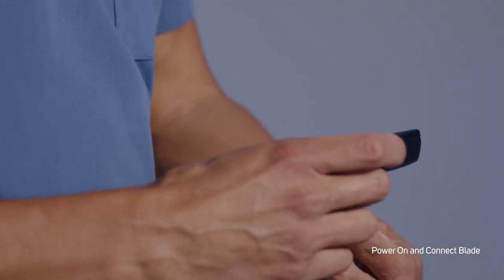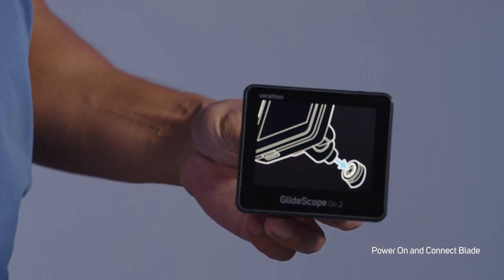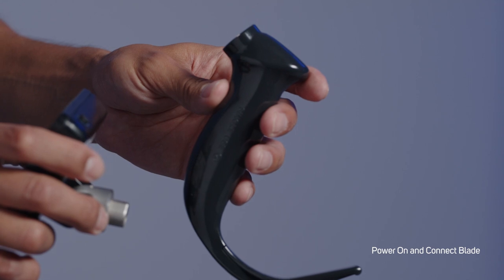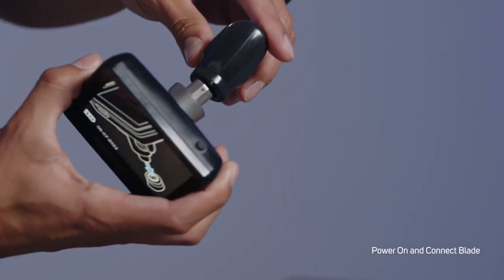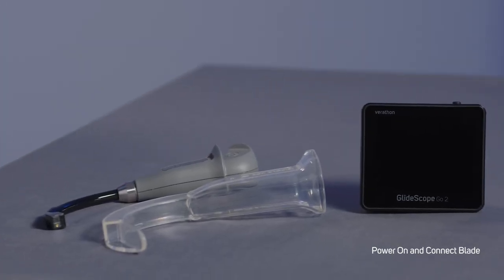Press the power button to turn on the device. The connection splash screen will appear showing that you need to connect a video laryngoscope. Choose your blade. I'm using a Spectrum QC Hyper-angulated S3 blade here. To connect, align the gray dots of the GlideScope Go 2 and the Spectrum QC blade. When aligned correctly, the two will magnetically connect. Video Baton QC Large and GVL Stats 3 and 4 are also compatible with Go 2.